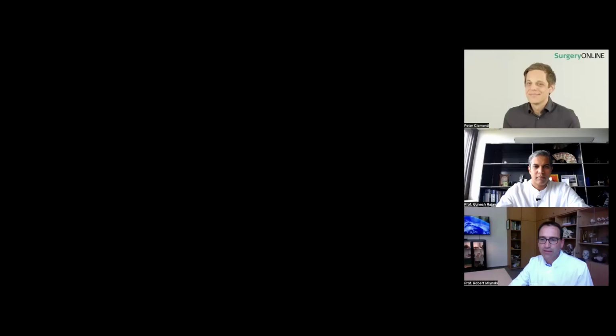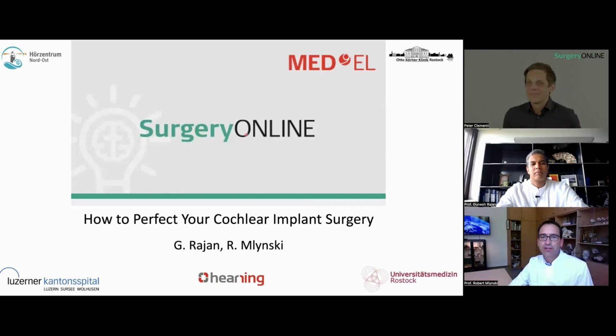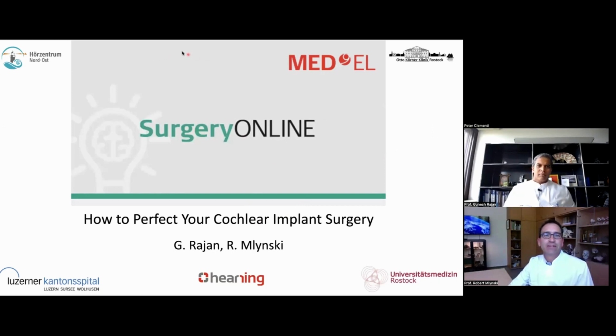Professor Rajan and me, Gunesh and me, will take you through our concept of cochlear implant surgery. We will talk about certain steps, how we categorize our surgery and discuss it, how we both do it, and we hope we help you addressing certain aspects what makes sometimes the life difficult. So I'm going to share my presentation, which should be seen now. Okay.